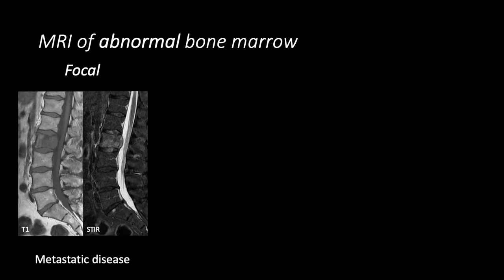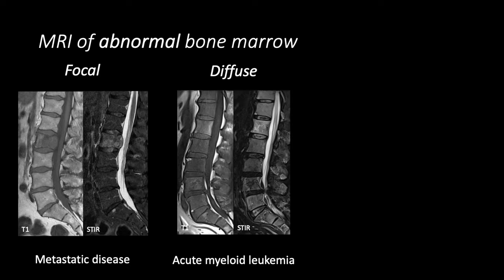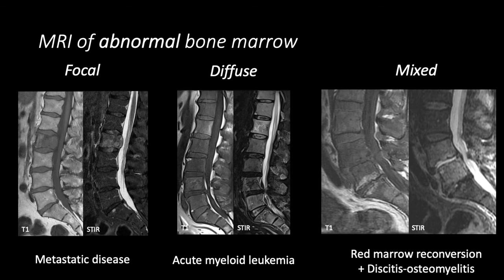Bone marrow signal abnormalities can be focal, such as in this patient with metastatic disease to the L2 vertebral body; diffuse, such as in this patient with acute myeloid leukemia; or mixed, as in this patient with red marrow reconversion due to chronic illness, as well as superimposed discitis osteomyelitis at the L4-L5 level, where we see increased signal intensity in the disc and within the vertebrae on STIR, with corresponding decreased signal on the T1-weighted image.